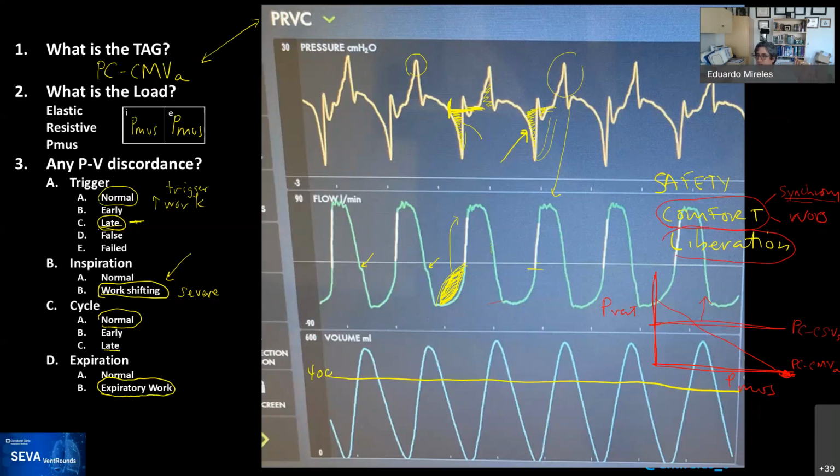You first have to check if there's acidosis, anxiety, pain, a very high VQ mismatch. Sometimes we see these patients breathing really fast, and the minute ventilation is 15, 20 liters per minute. They're doing all the work of breathing, but their gas exchange is poor, with a CO2 that is normal or elevated. And you know that when you take them out of support, they're going to be on their own, and then they're going to be in trouble again. So you have to factor that in, definitely.